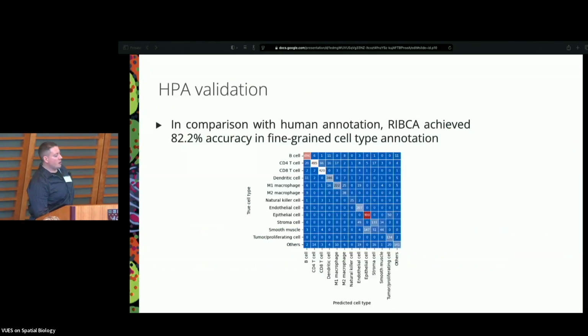Okay. So with validation, there is very high fidelity recreation of expert annotations, with everything on the main diagonal being quite large values. Some confusion here between what is that? Smooth muscle and epithelial cell.